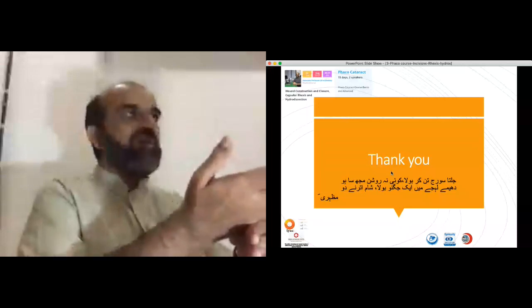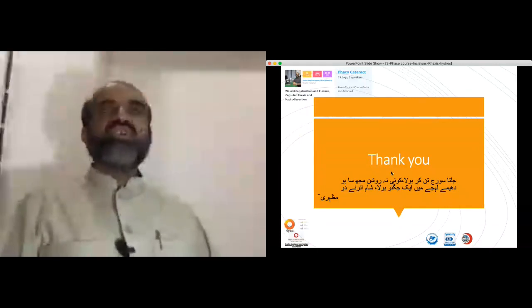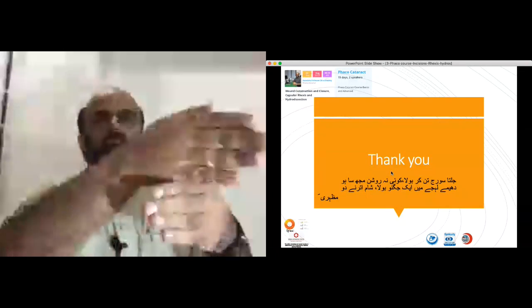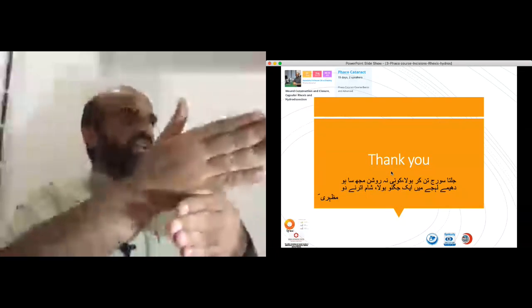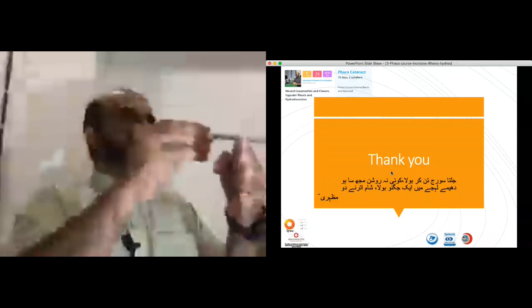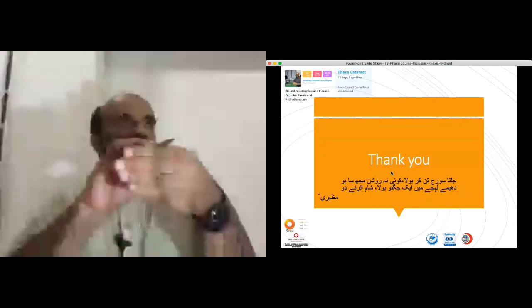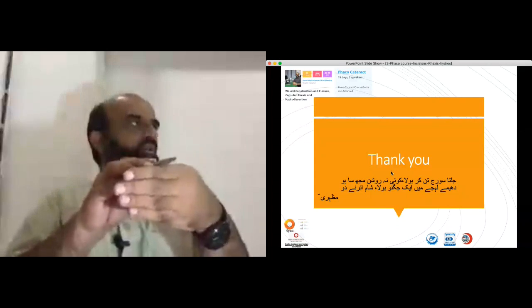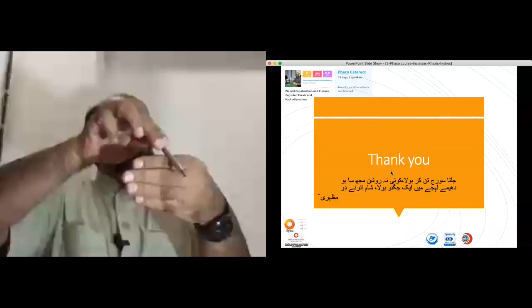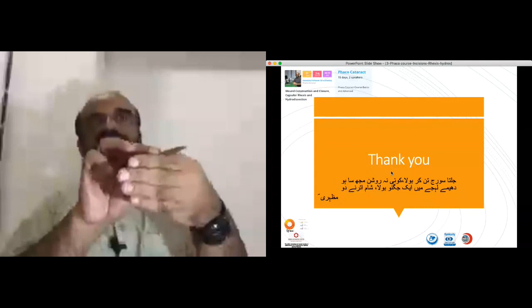You understand the fulcrum? The fulcrum is a concept of a lever. In physics books, we used to study the principle of a lever. It is a kind of bar which keeps on moving on a certain pivot, a central point. That is known as the fulcrum. So once your needle is there, the tendency of the beginner is to depress the whole complex down. No, this is not what you need. What you need is, if you want to dip your tip, raise the outside part. If you want to lift your tip, depress the outside part. Don't depress your incision. That's what I mean.